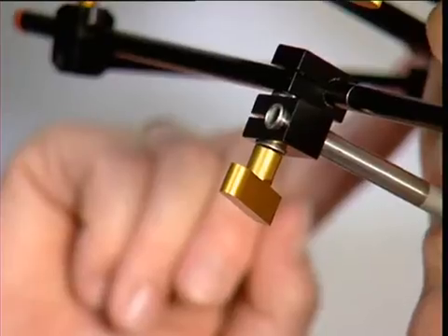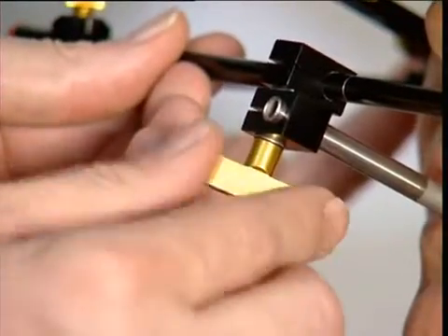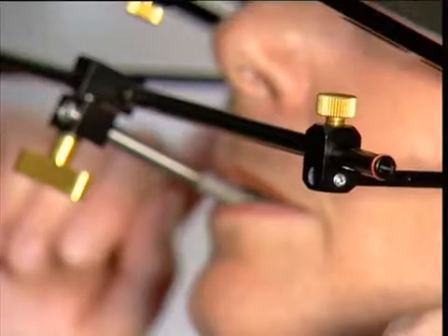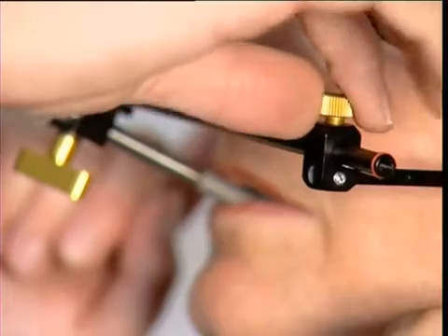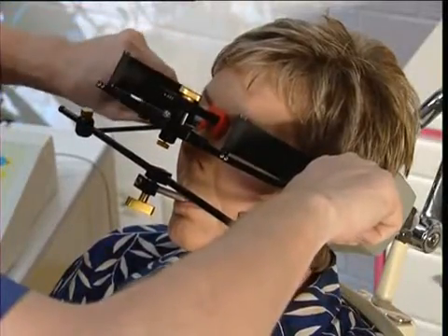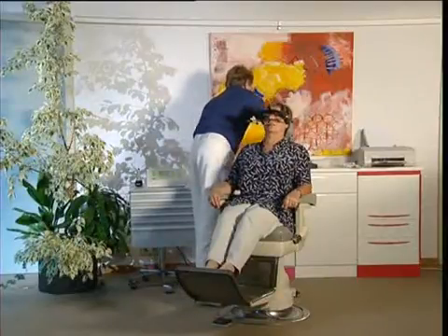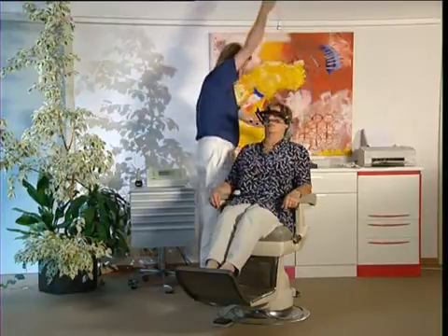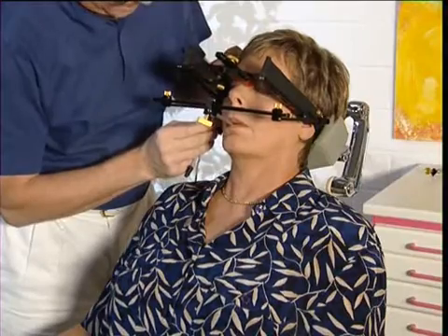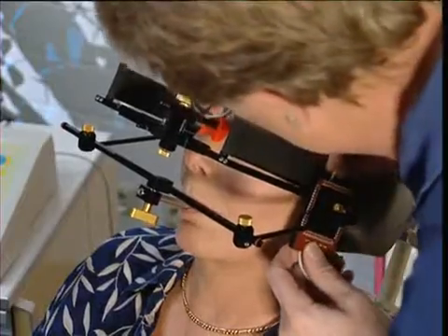The transverse rod is rotated to relieve both side arms and the T-screw tightened to secure the lower tracing plate firmly on the anterior tray. Both side arms are then fixed to the transverse rod with the sure grip screws and both fitting tools removed. The side arms must be held in place securely during this procedure. The electronic tracing sheets are then fixed to the tracing plates.